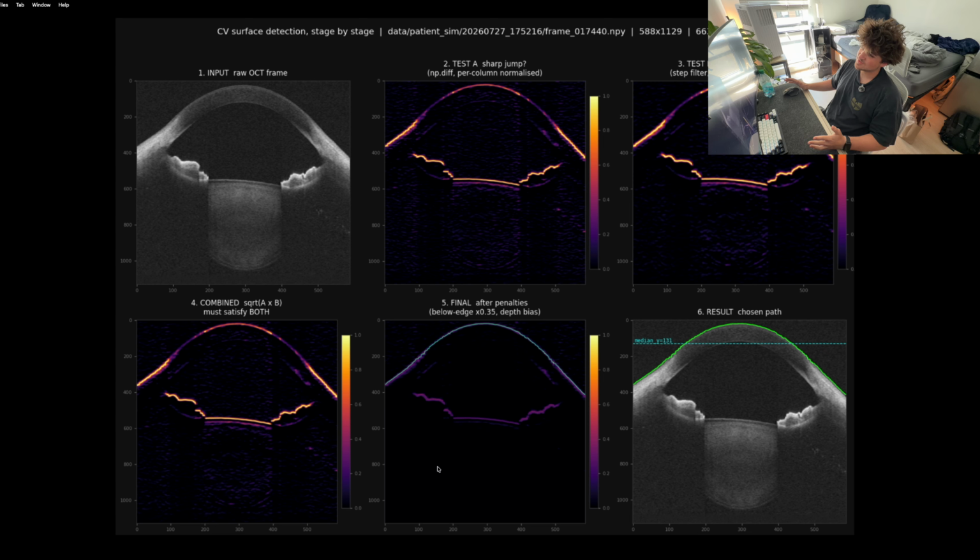And then we apply a series of penalties that would differentiate these brighter regions as opposed to these brighter regions. This is the cornea that we're looking for. These are not part of the cornea, or at least not part of what we're trying to detect. Usually, the higher the detected bright spots, the more likely it is a cornea. This scoring system works because for anything lower than what's expected, you can apply penalties that will further lower the score, which is ultimately why this region isn't represented as a detected surface, but this is. This is much higher, so the score is much more favorable. So the path selection favors this trend.